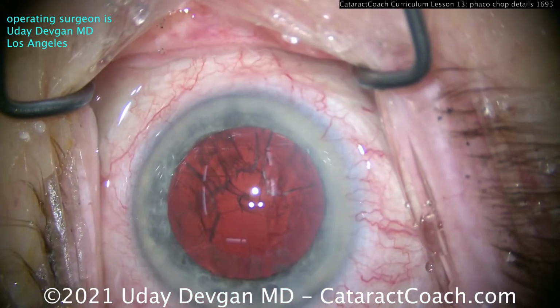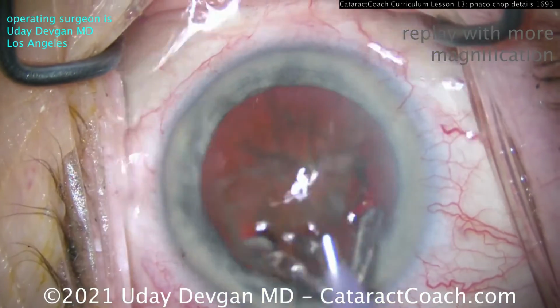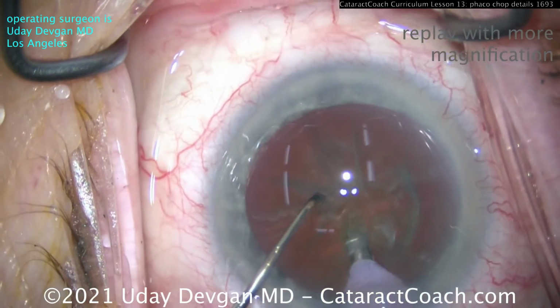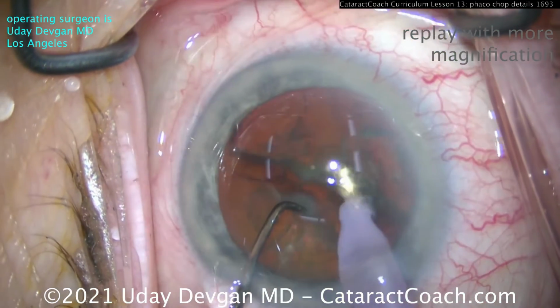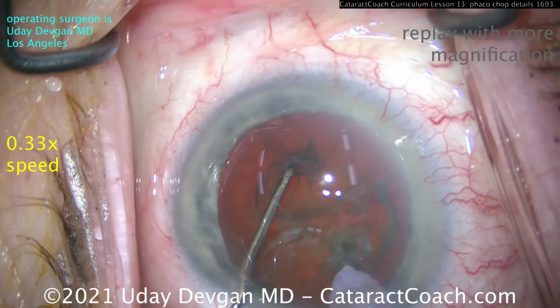I'll show it to you in higher magnification, and then we'll repeat and show you in slow motion. So again, phaco probe here in high mag, you can see we're placing it just inside that subincisional capsulorhexis. The chopper is pushed into the nucleus straight down, and then bring the instruments together and apart to create two halves. Really nice. Now let's watch it with slow motion. This is at 1/3 normal speed.